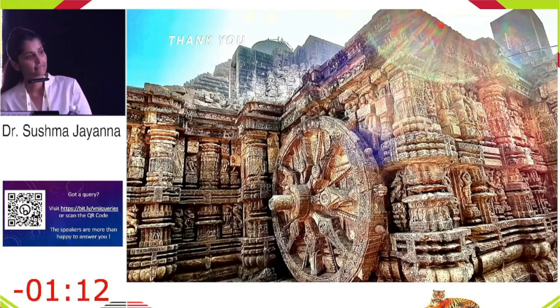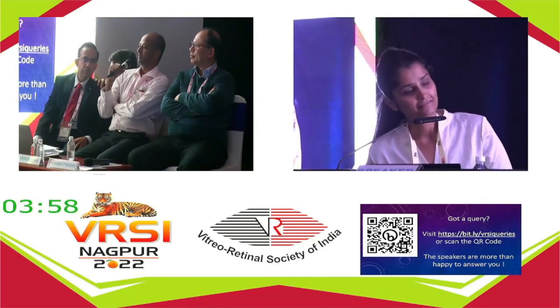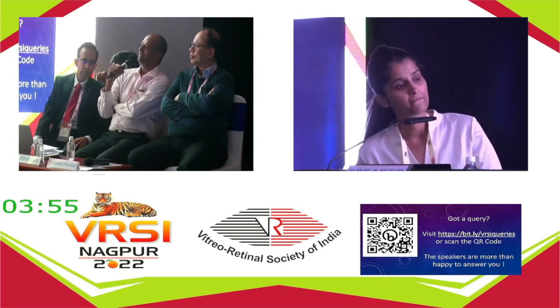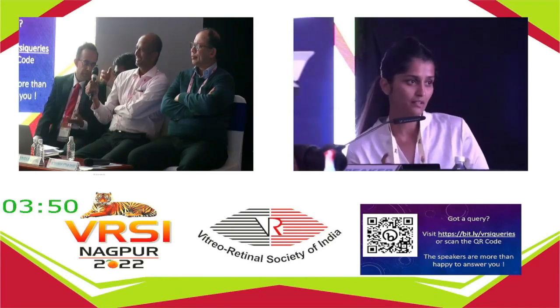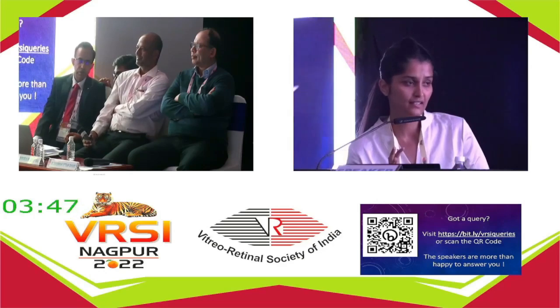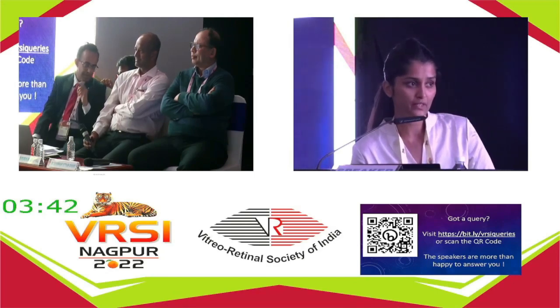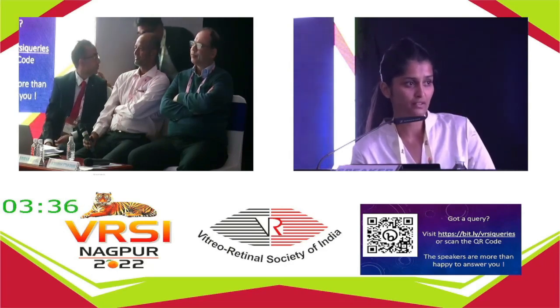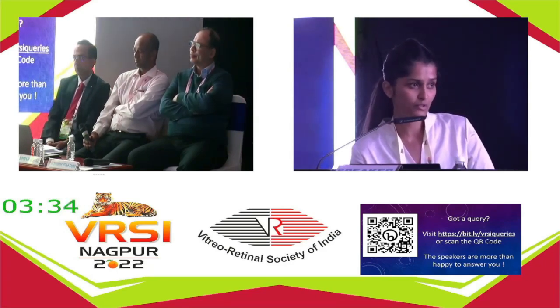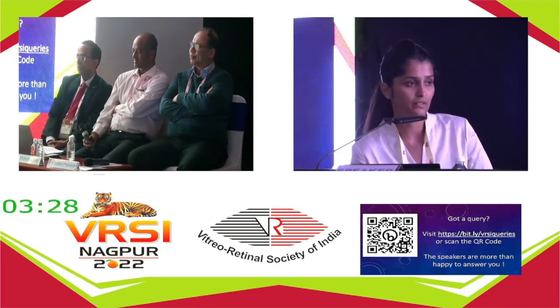Thank you, Dr. Sushma. That was a brilliant idea and excellent images. I had a practical doubt. When you apply topical anesthetic and put a speculum, the cornea is going to dry up very quickly. So how quickly did you manage to take the images per eye? I did not mention the time taken to just click. It hardly takes 3 to 4 seconds. Once the pupillary alignment is achieved, just a click will be done with the imaging. While achieving the alignment, we might have to put refresh tears or lubricants 2-3 times. But once the alignment is achieved, it hardly takes 1 or 2 seconds to click the image.